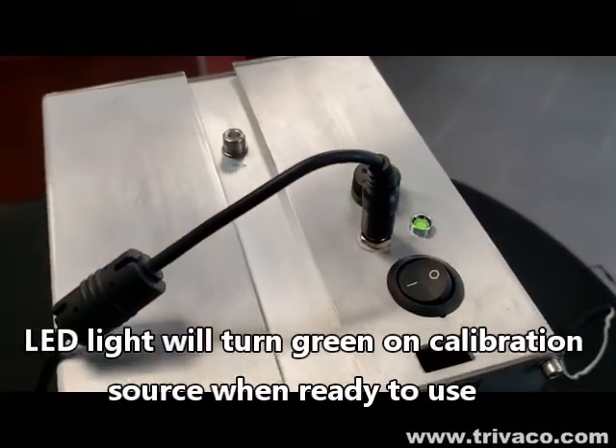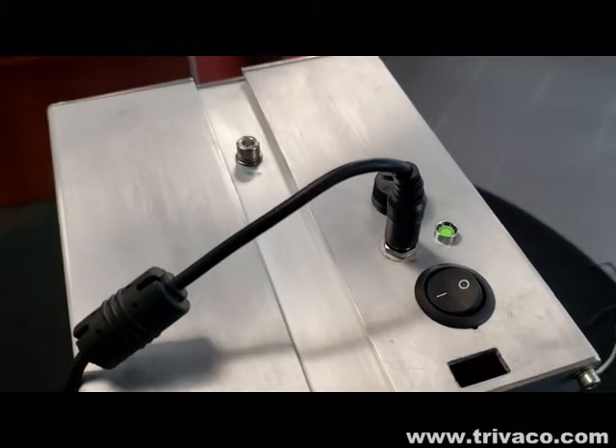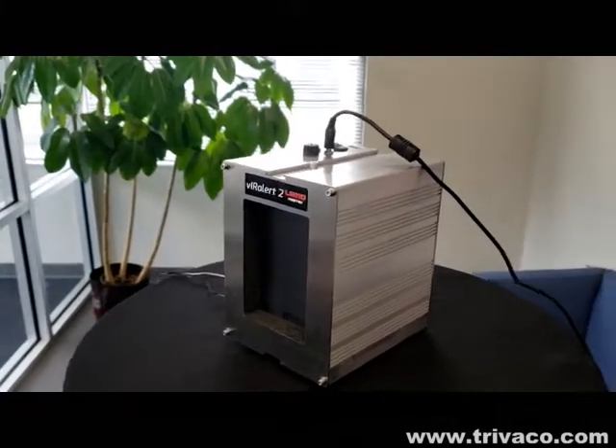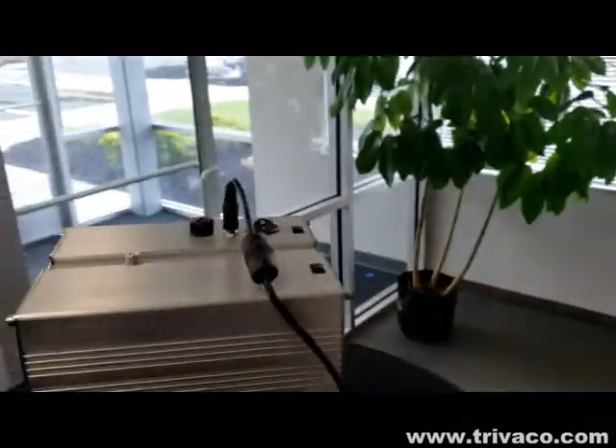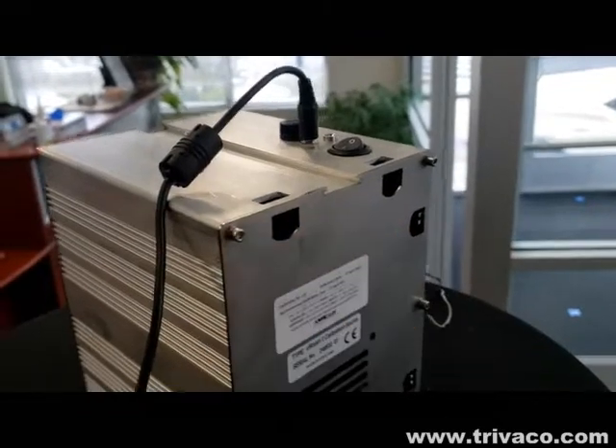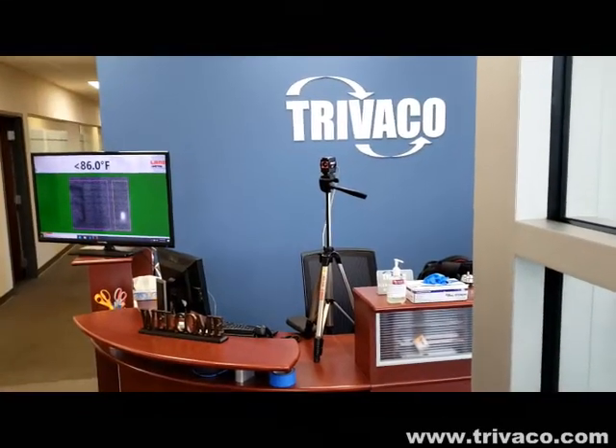The cal source is ready, as indicated by the green LED. One thing to note is that this unit is designed to be wall-mounted through the eyelets. Now we're going to begin the vetting process.